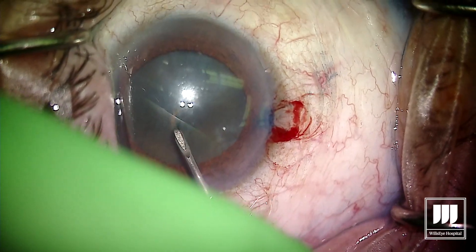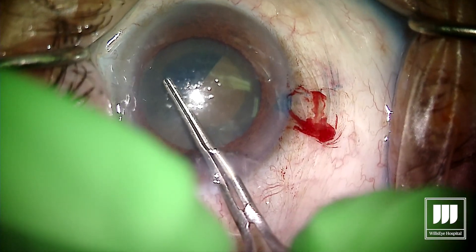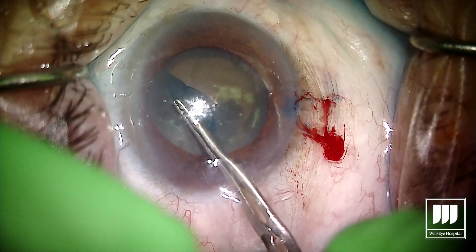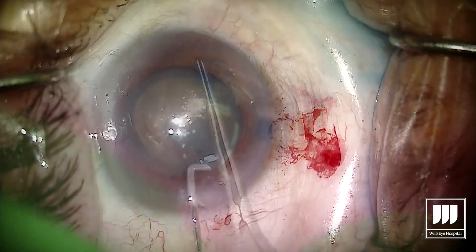So we're using trypan blue to stain the capsule and I'm going to try and make this capsulorhexis as large as we safely can. Luckily, in these leathery brown cataracts we don't usually have to deal with the intralenticular pressure and that feared Argentinian flag sign.